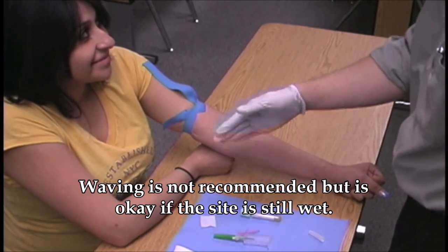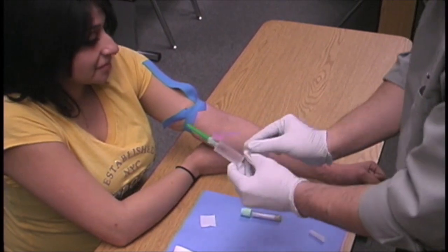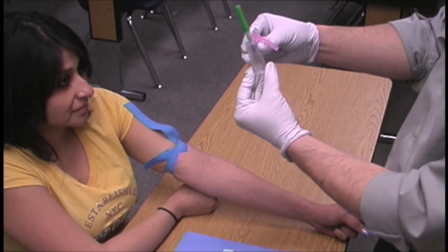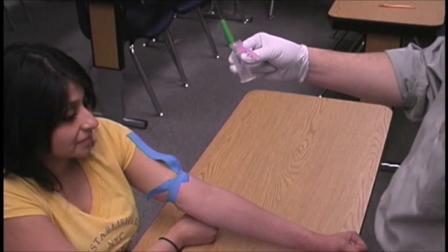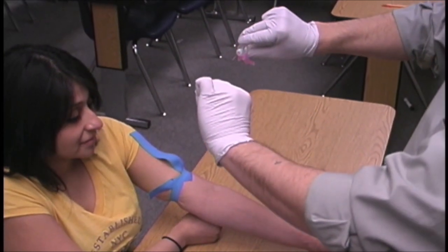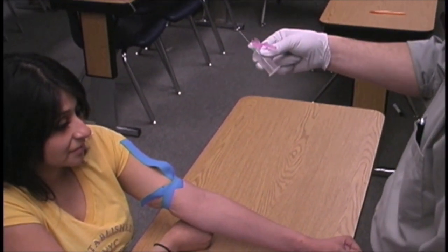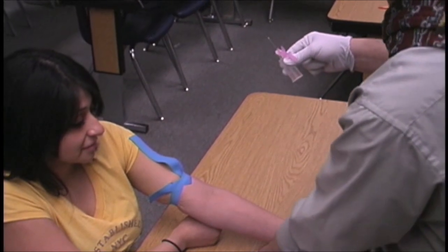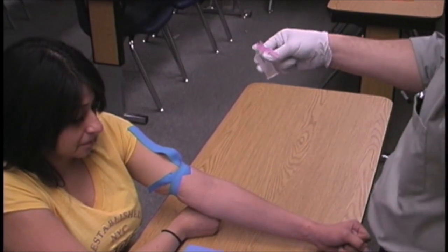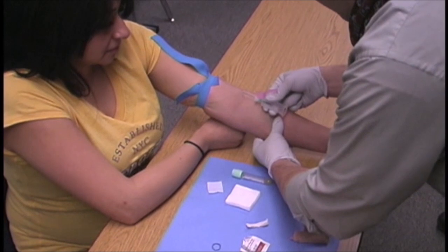He picks up his vacutainer holder and multi-sample needle. Notice he puts two fingers on the bottom and his thumb on top, rolling the rest of his fingers in. He holds it horizontally, pulls the cap off, retracts it, puts the cap down, and inverts it back up. He is now in the draw position with the bevel up. He gets his two-by-twos and his tube close to him, then retracts the skin with his left hand.